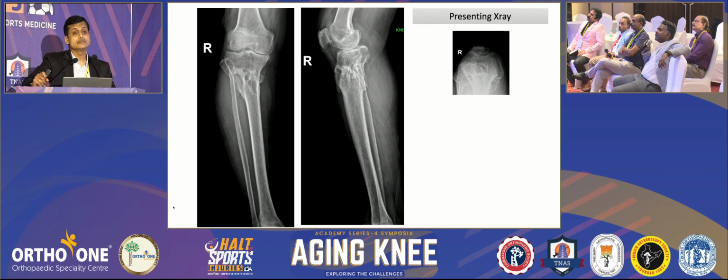This patient has joint space reduction medially. Other findings, quickly? I can see some changes in the patellofemoral aspect as well. And obviously there is a malunion, or we can say a united fracture in the metaphysis of the proximal tibia. Definitely there is arthritis, medial compartment OA, and proximal tibia fracture malunion, with a deformity. So this patient needs a total knee, definitely.